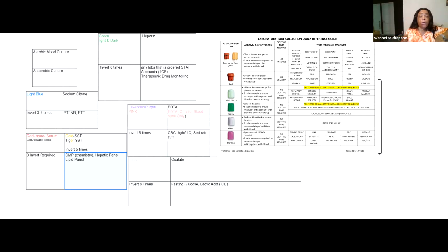Then when we go over to its neighbors, which is what you're going to really see in real life, I don't want to confuse you guys. And why is CLSI still advertising the red top tube when we use the gold top or the tiger top all the time? I don't know. But just keep in mind that the gold top and the tiger top is a serum tube. It's SST. The additive that's in those tubes is a gel additive, which is the SST. Those are still made to clot because they're all serum tubes, okay?